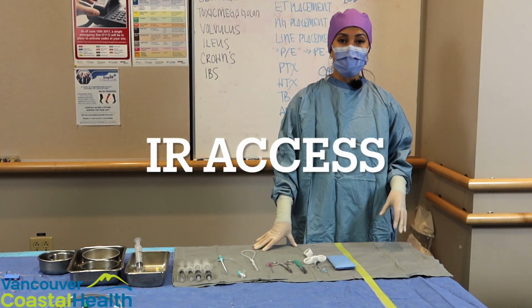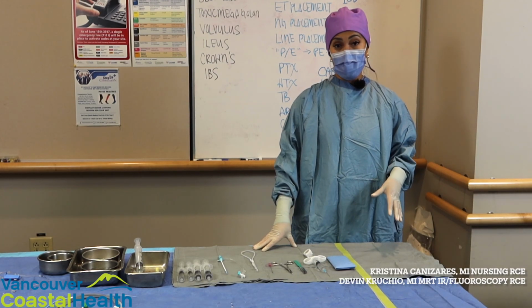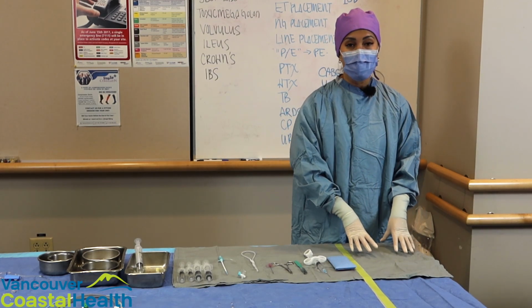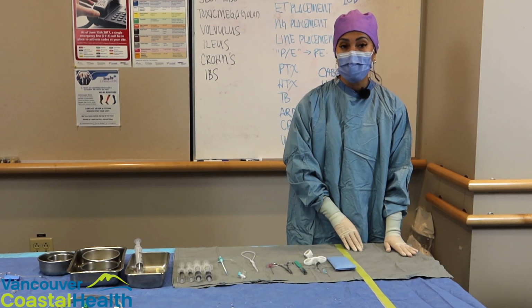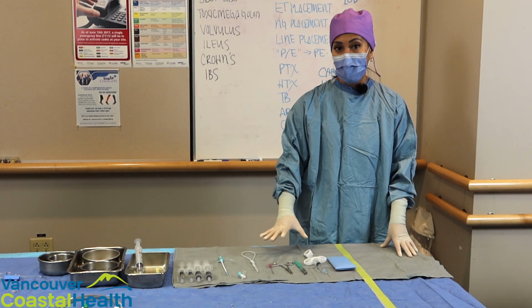We're going to demonstrate accessing into a patient using Seldinger technique. For this portion of the demonstration, I'm going to pretend that I'm the physician, not the scrub assistant. And we're going to pretend that this is the patient access site, whether that be IJ, radial, femoral, percutaneous. This side of the green line is the patient, and then here is the demonstration of our sterile tray.